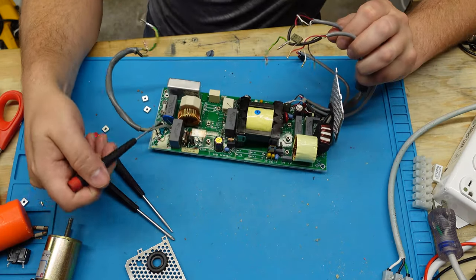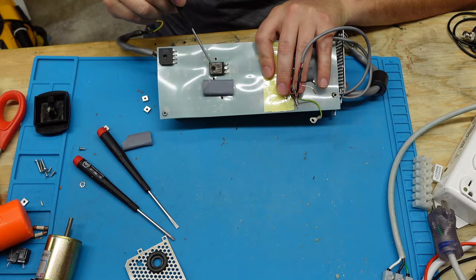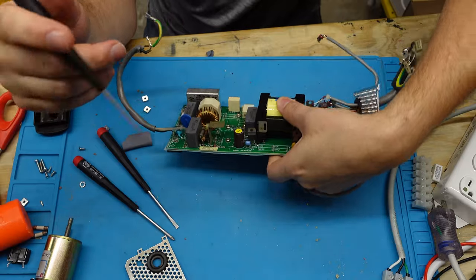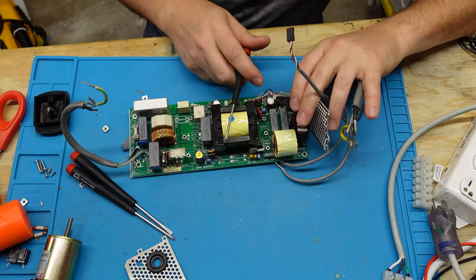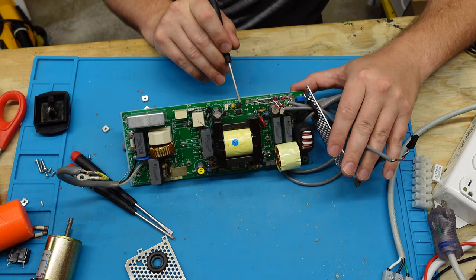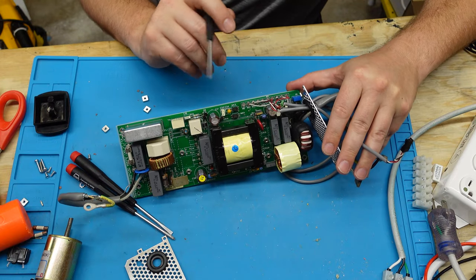Your DC bus is down here. And from there, it goes into your, there's a couple MOSFETs right here on the bottom. See that? So here's your bridge rectifier. Here's one of your MOSFETs that does your switching. And your switching goes through your transformer. And right here is basically the dissection of the board. So technically there's not anything from this side that connects to this side. Right here's your feedback circuit, which is what I was assuming was going to be the problem, because it was appearing like it just couldn't regulate its power correctly. And these ones right here are opto-isolators.